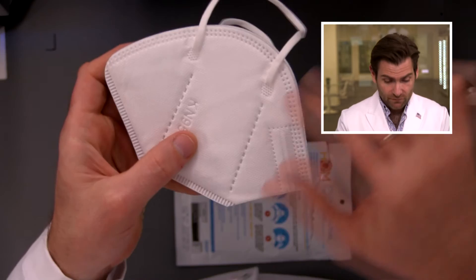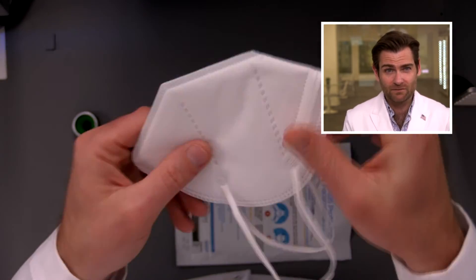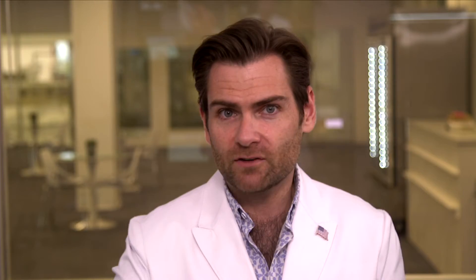I don't think this is an actual KN95 because with the KN95 standard in China you have to have the standard listed on the mask — just like with N95 you have to have a specific number. That's making me question them. Let's do the ear loop test real quick and then we'll look at the results. That's pretty good.